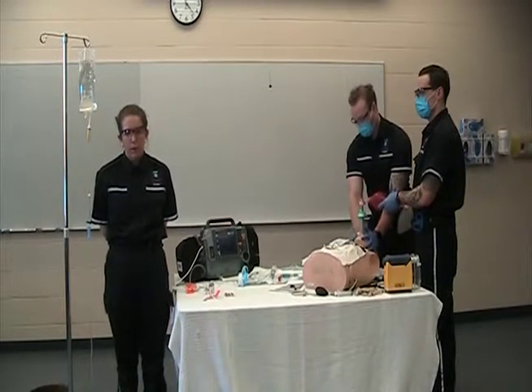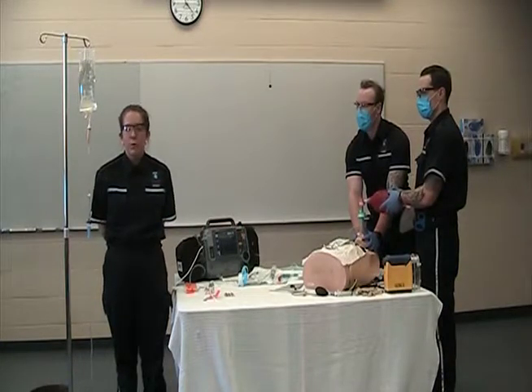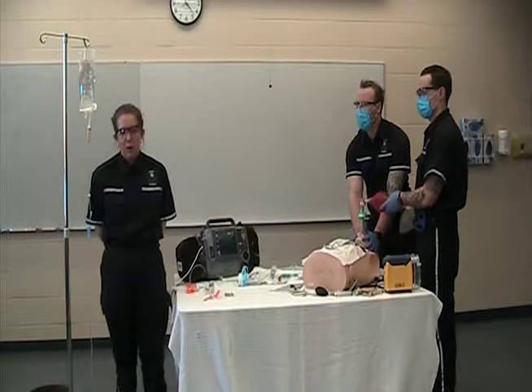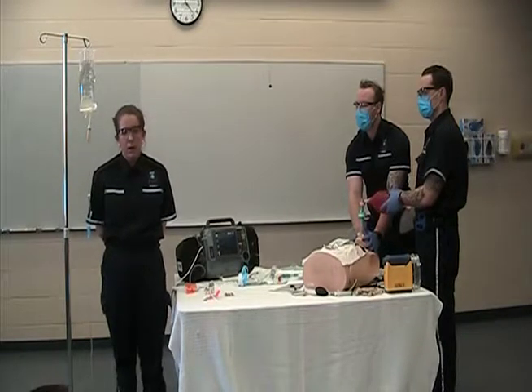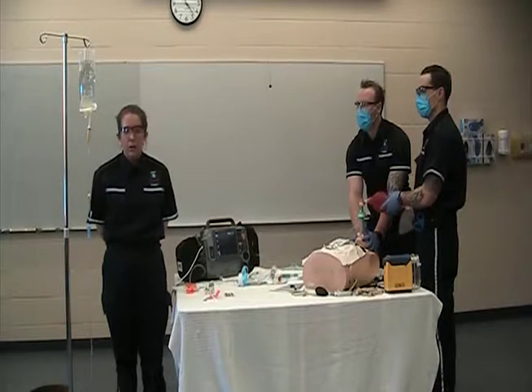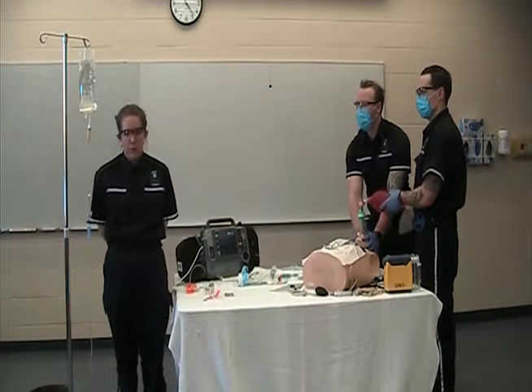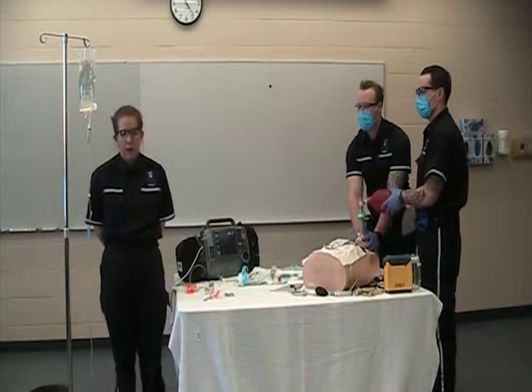I'm an advanced care paramedic student here at SAIT, and I'm going to be walking you through the steps to a successful rapid sequence intubation. A rapid sequence intubation is a combination of a sedative and a paralytic that is pushed rapidly through an IV push in an attempt to get a good advanced airway placement. For our induction agents, we're going to be using ketamine. You can also use midazolam and fentanyl, but for our purposes, we're just going to concentrate on ketamine.